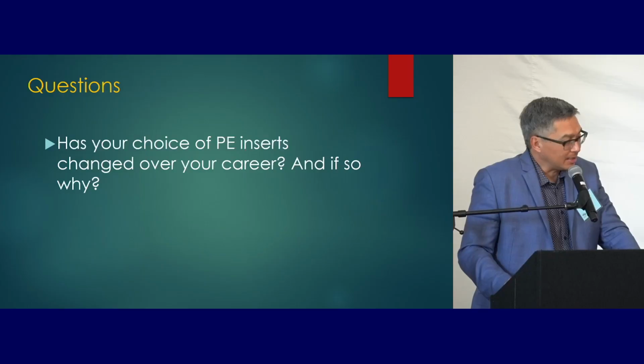I think the data on medial congruent looks really, really promising. Emerging data shows that that's perhaps something we should consider, particularly in some of these severe deformities. So Keith, why did you switch? You said you're a traditional gap balance PS, and now you've gone to medial stabilized. Some of the data, looking at these medial congruent, medial stabilized designs, but also I just got tired of listening to the patients talk about the box post kind of noise that it makes, and just didn't want to cut a box. Be more bone preserving.